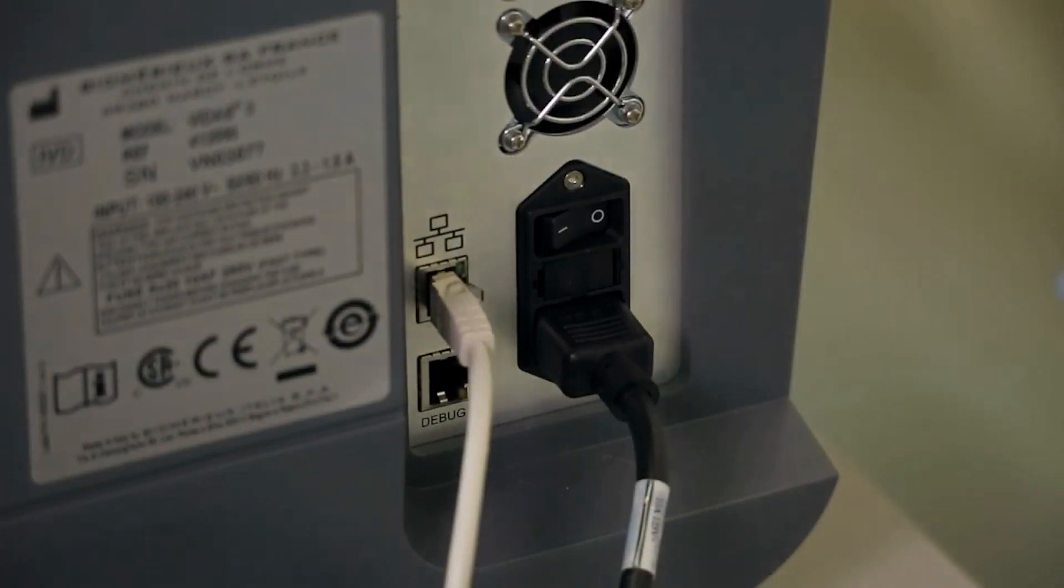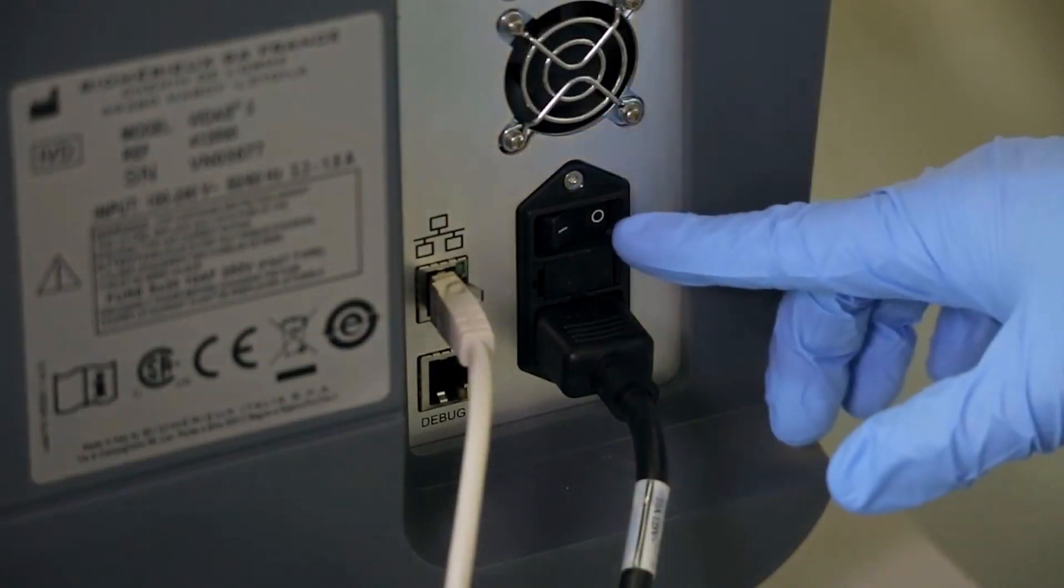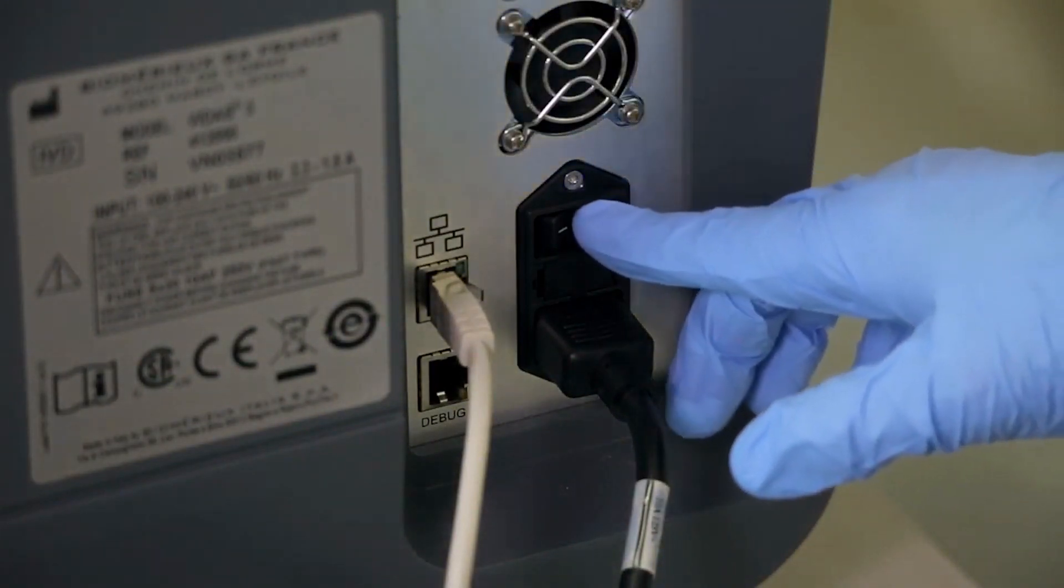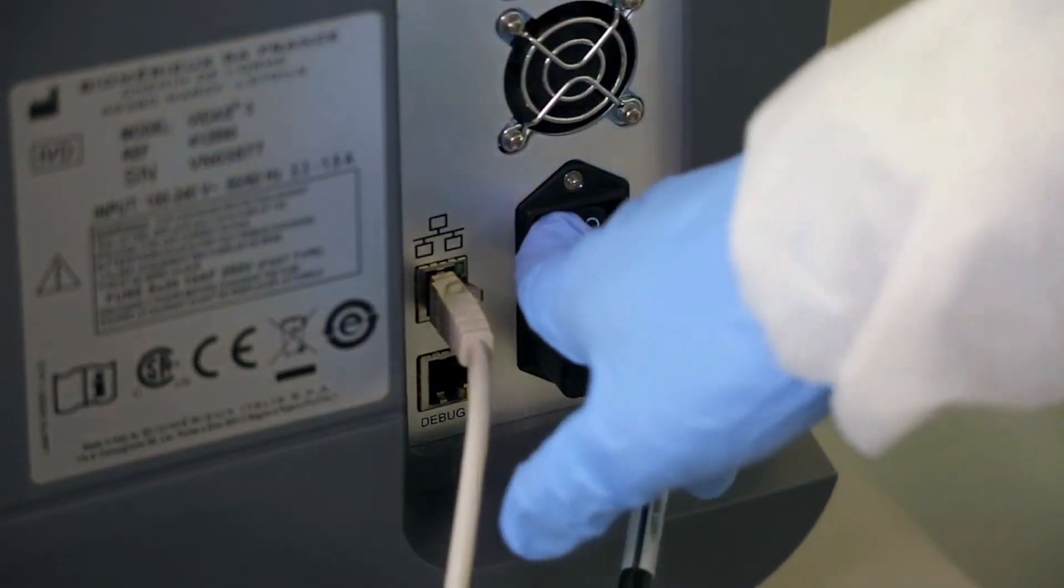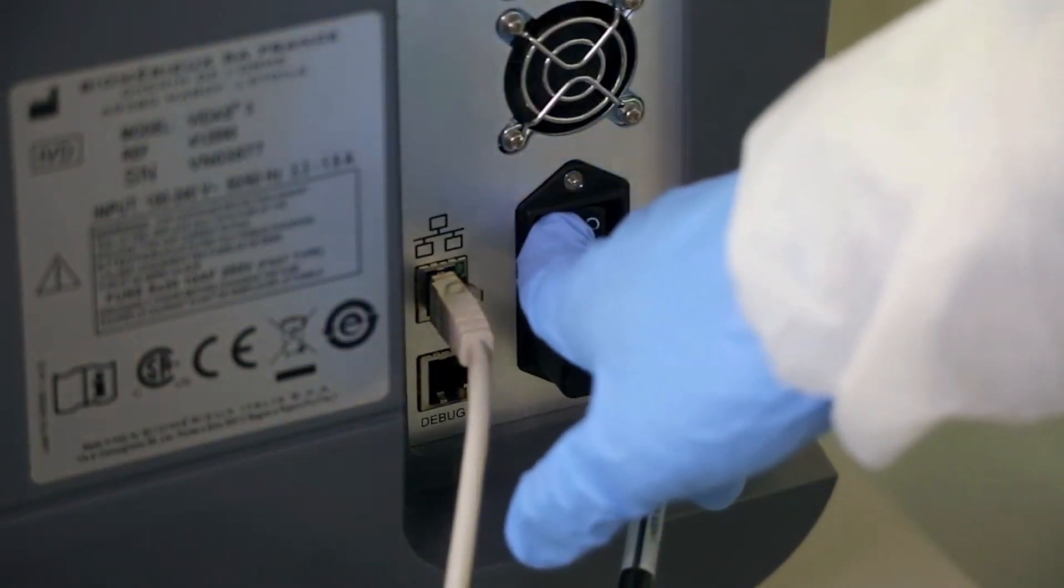Reconnect the power cord. Turn on the instrument and wait for the initialization process to complete.